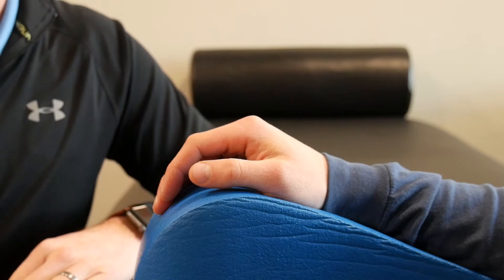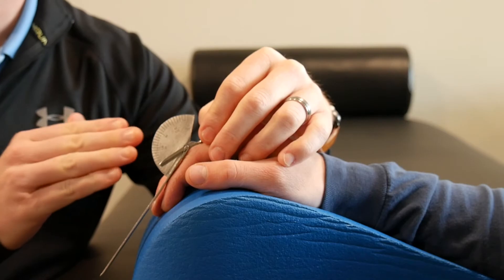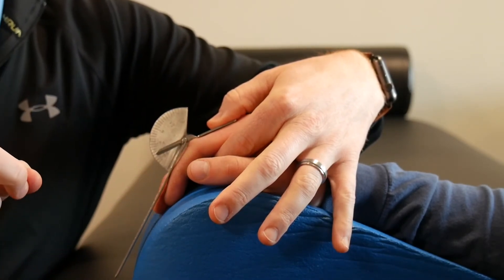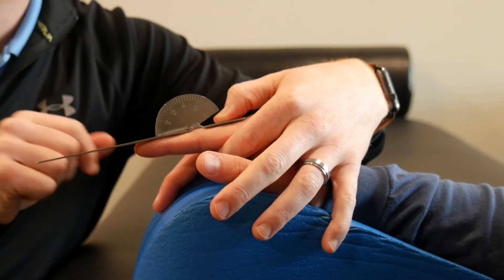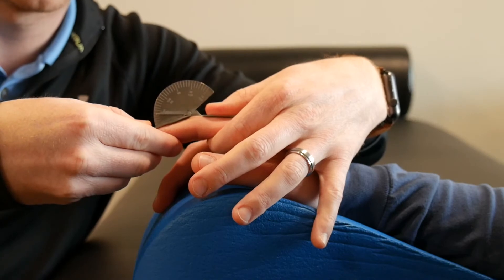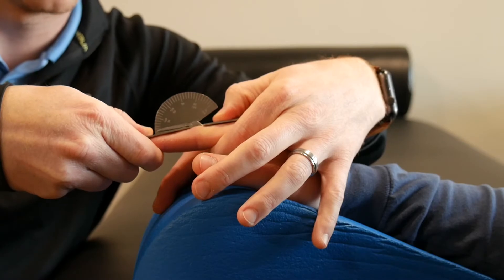Next we're going to measure PIP extension. Very similar to the MP joint — lay it right on the dorsum of the finger, in line with the proximal phalanx. Sometimes you can come here and support the volar surface of that joint as well. Ask the patient to straighten their fingers as far as they can go. When they bottom that out, you know you're at a zero measurement. If he's not able to get to zero — say he's getting to around 25 degrees — for a passive measurement you're just going to take that joint as far as they can tolerate or as far as you feel it's necessary.